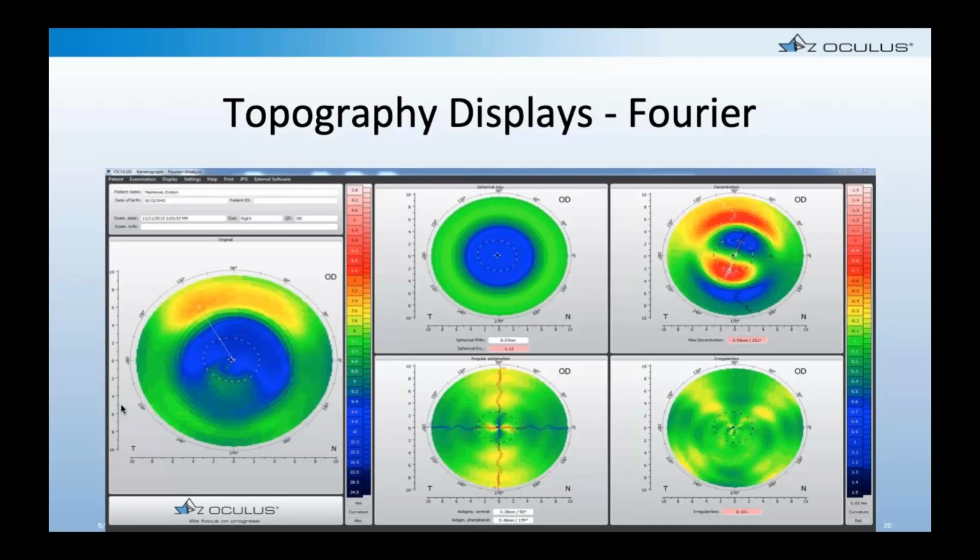It's allowing for an incomplete correction on the inferior part of the treatment zone, and that incomplete correction is leaving them myopic enough that it has a significant visual consequence. So again, this is a patient where just looking at the map on the left, you might say, I can't really tell whether the patient just needs more correction or if this little island of green below is that significant. The Fourier display can bring that out and show you whether it is visually significant or not.